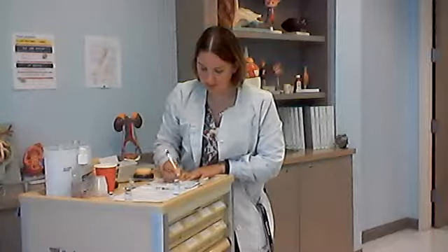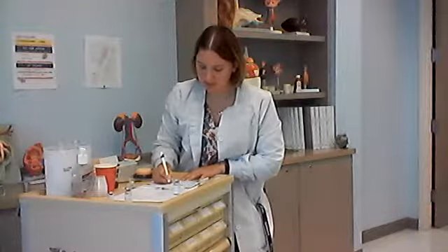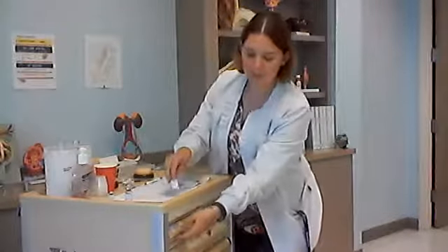Now as I write my label, I'm going to be doing my second check. So I have Mr. Terrence Walker, 15461. I have heparin, 5,000 units. It is a sub-Q. Time is now, and I will document at the end. So the right patient, the right drug, right dose, right route, time, and documentation. I'm going to label my syringe, and I'm going to put my heparin away.